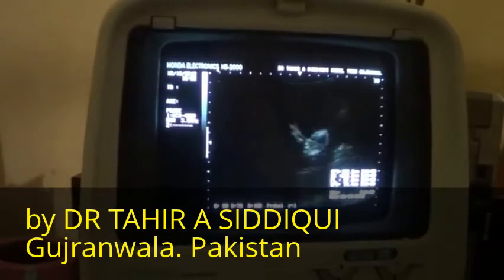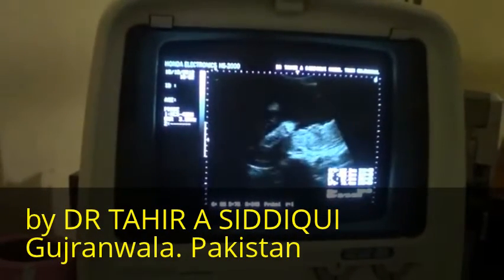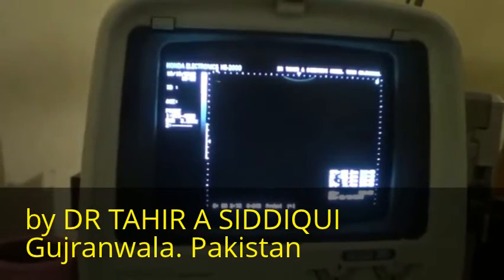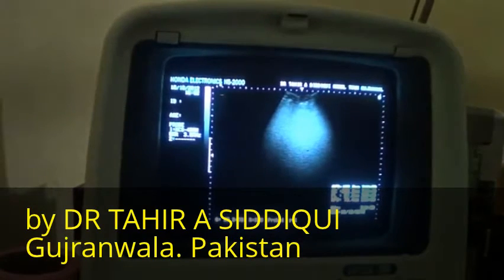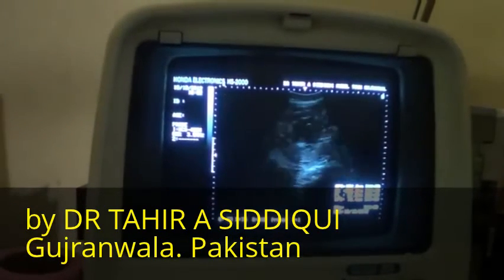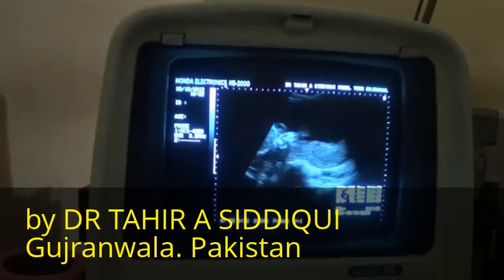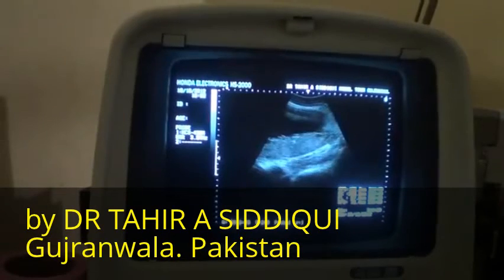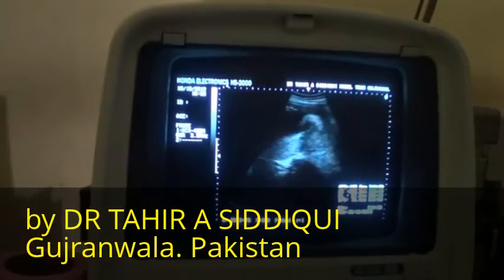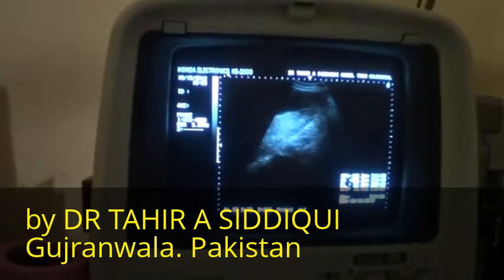Now you see that there is a significant amount of fluid, which corresponds with the definition of hydramnios. The placenta is still, you can trace it down up to the cervix.